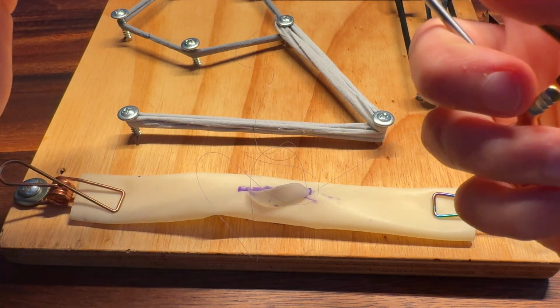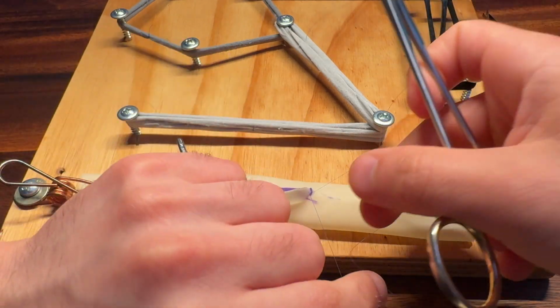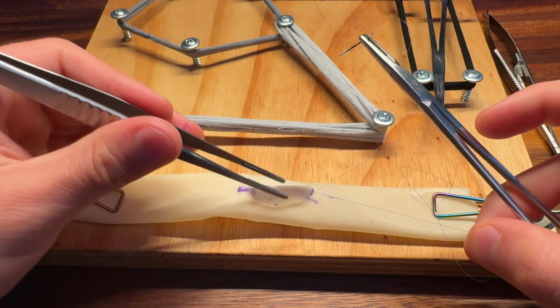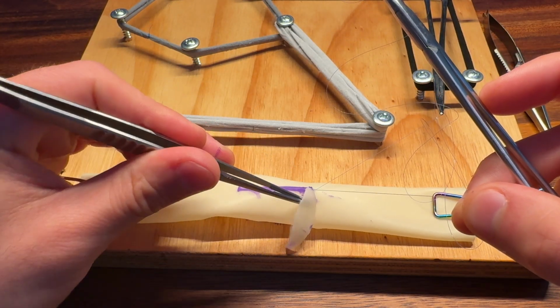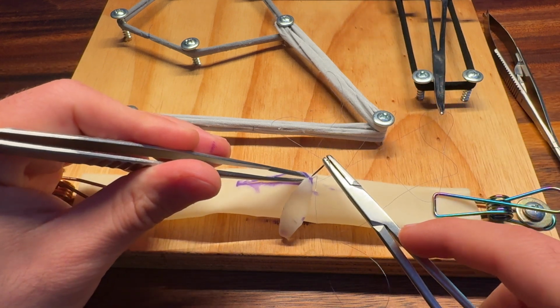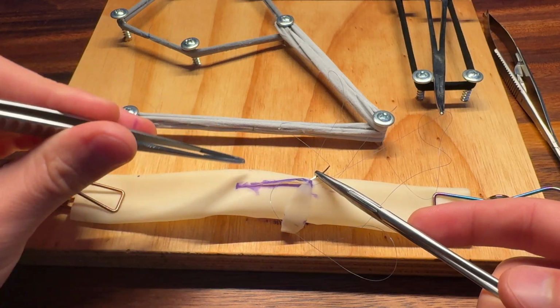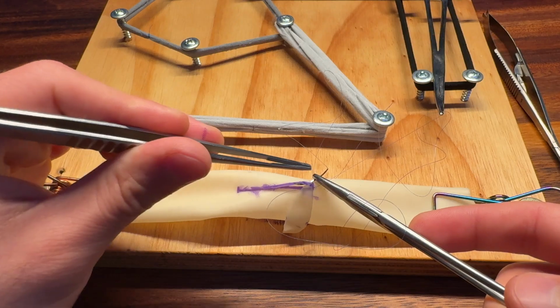But really what you want to avoid is crossing your suture. So I'm going to pull this aside a little bit. And notice that we're on the outside of the blood vessel, which means that the next throw has to be on the inside. So I'm going to move this aside, and I'm going to make my throw here. And I'm going to continue this pattern all the way through. So I'm going to see you back when I'm at the apex, okay?